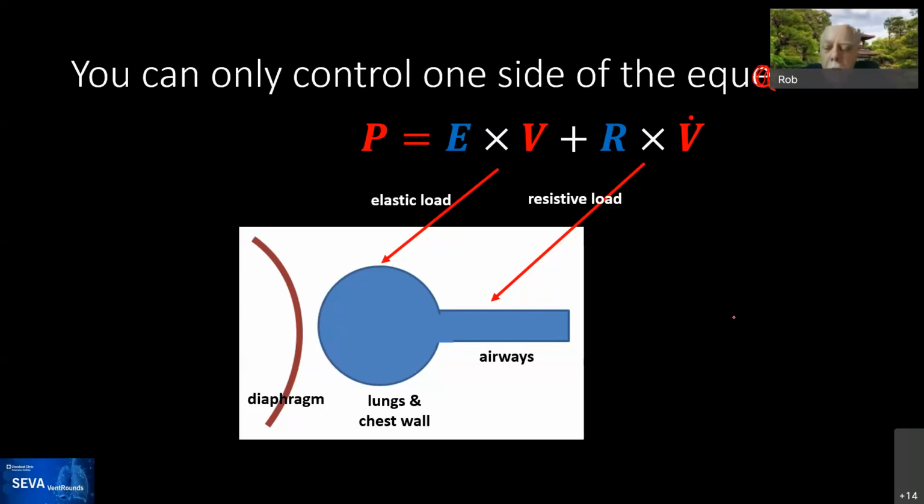So anyways, this model is fairly simple, at least it looks simple, and it's called the equation of motion for the respiratory system. And it looks like an algebraic equation, but in fact, it's a differential equation that was derived from calculus. And believe it or not, the godfathers of pulmonary physiology were mathematicians. They knew all this stuff, and so they were familiar with using this equation, like Otis and Mead and those guys. And anyways, we have used it. We've adapted it in a simpler form to be the theoretical framework for selecting modes of ventilation.